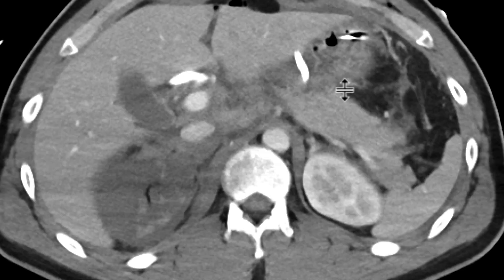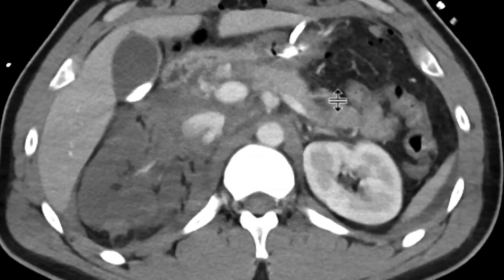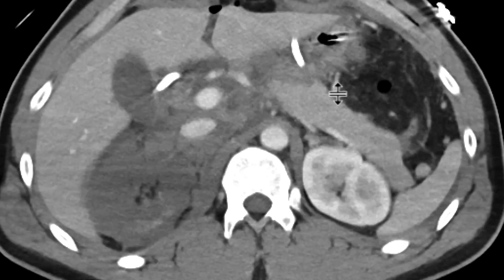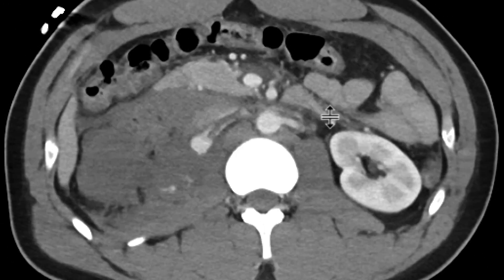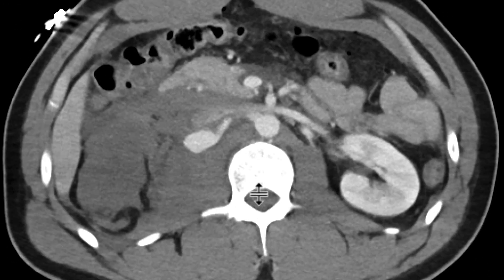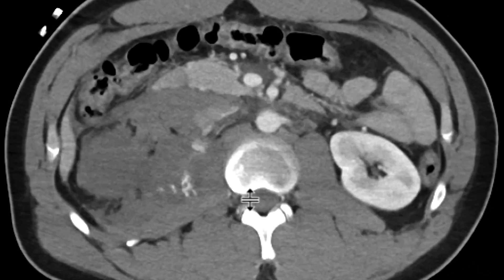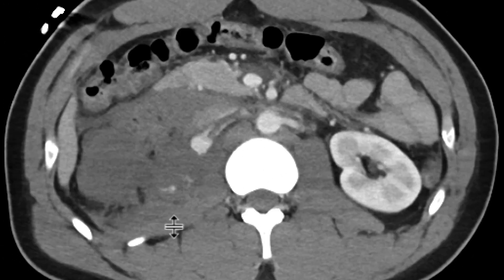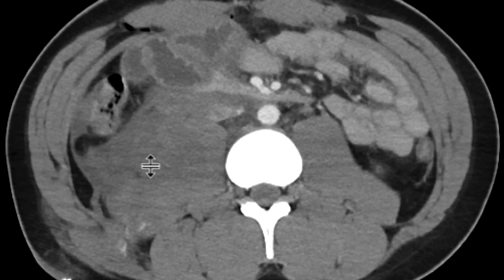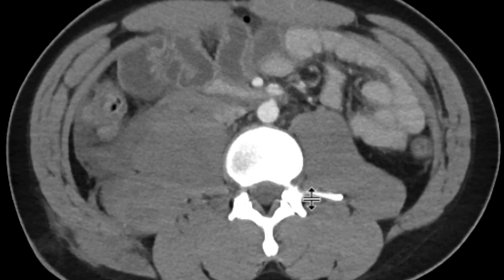The abnormality is really centered in the right kidney. You can see the right kidney is essentially devascularized — there's no perfusion there. The right renal artery is severed; there's no right renal artery perfusing that right kidney. In fact, there's active extravasation within that right renal artery leading to this hematoma on the right side of the abdomen.